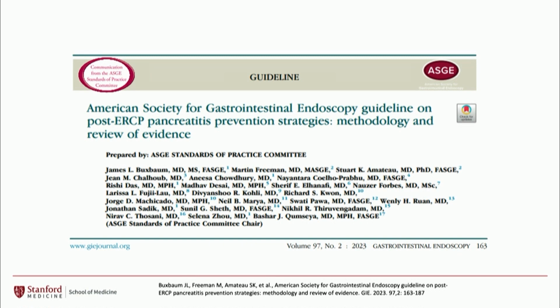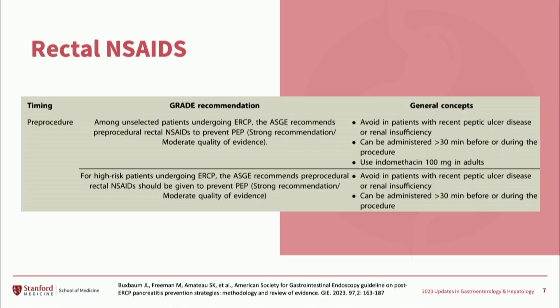They performed a systematic review and meta-analysis of many dozens of trials answering 5 specific questions, which we'll go through, and I think this is probably the most up-to-date and comprehensive overview of the current state of prevention of post-ERCP pancreatitis.